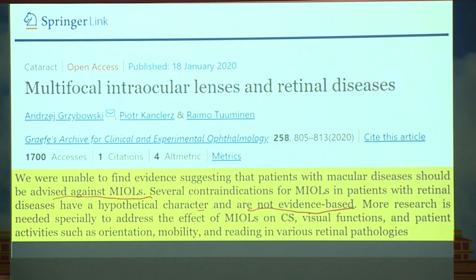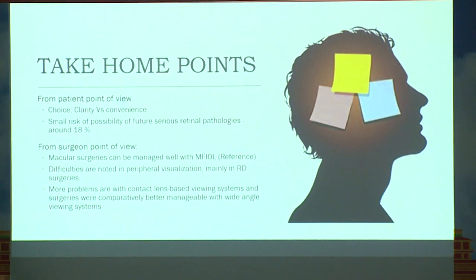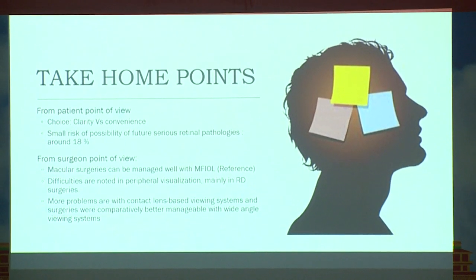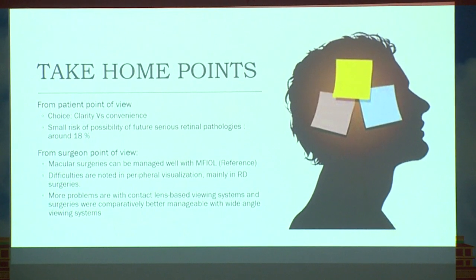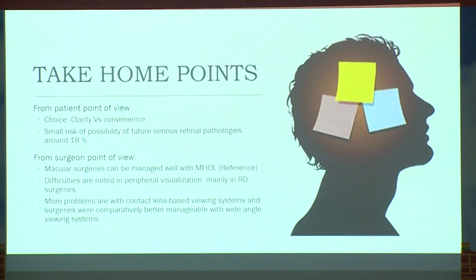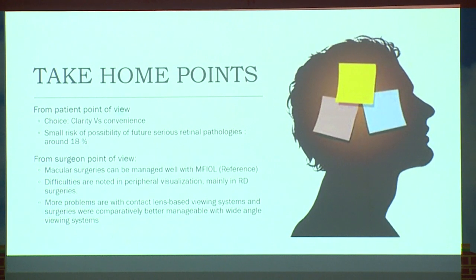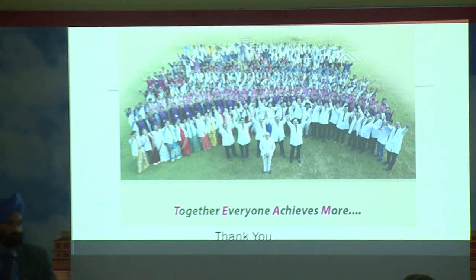More research is needed, especially to address the effect of multifocal IOL on visual functions, contrast sensitivity, and the patient's activity, orientation, mobility, and various retinal pathologies. So definitely, again, it's between the patient's perspective and choice versus the small risk of 18% versus the surgeon's point of view. Definitely we can overcome a lot of these, even in case of doing lasers or retinal surgeries. Thank you very much for the patient listening. Thank you, sir.